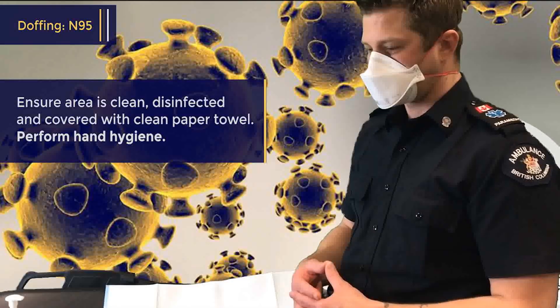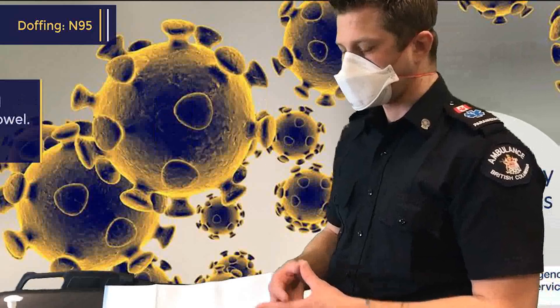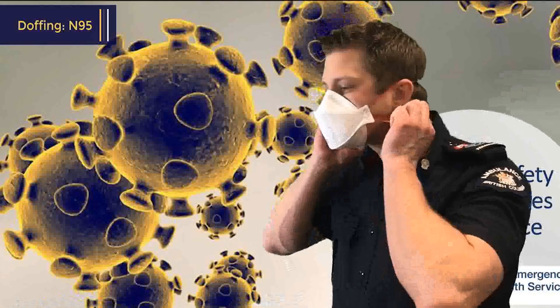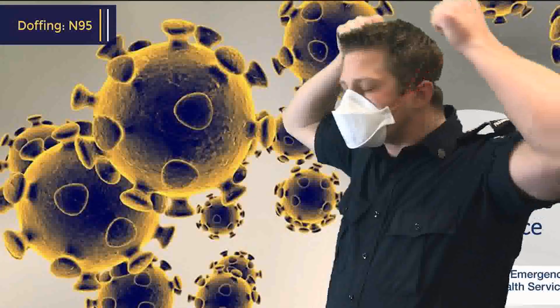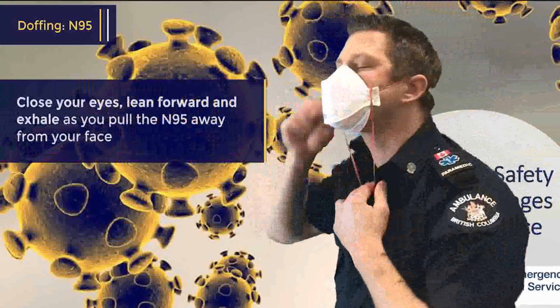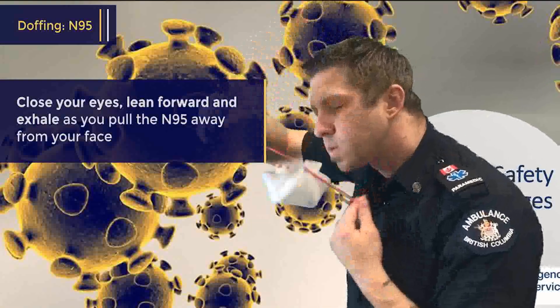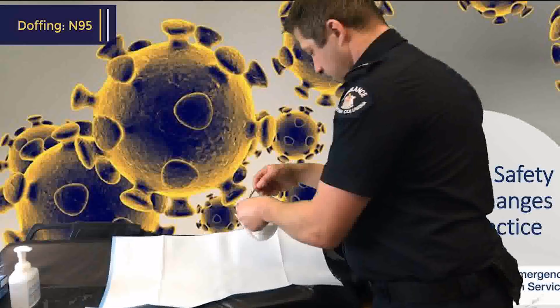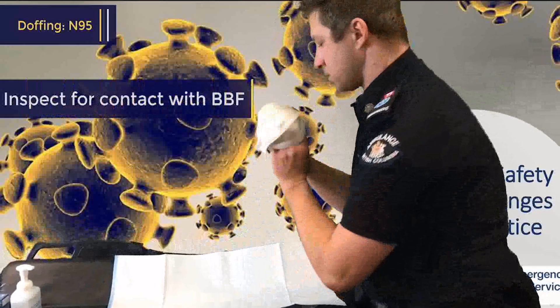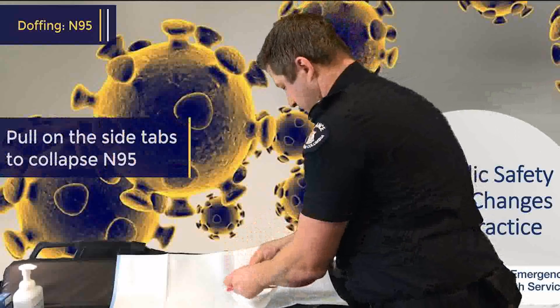So you need to take your N95 off as you would normally. Close your eyes and exhale. Remove downwards. Conduct a visual inspection to make sure it's not coming into contact with any blood or body fluids, and collapse the mask for storage by pulling on the side tabs.